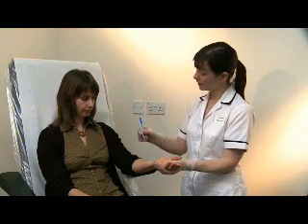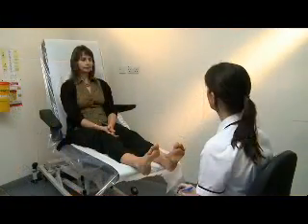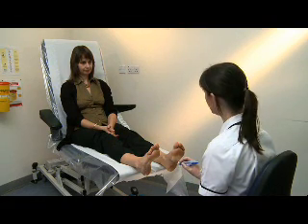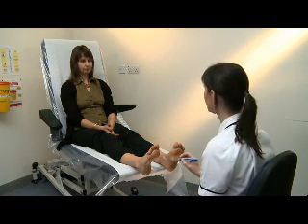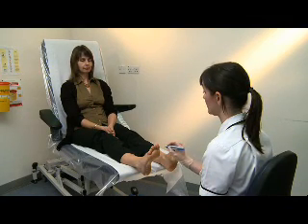And if you close your eyes, can you still feel it? Yes. Okay. I am now going to test the sensation in your feet, so if you'd like to close your eyes and just say yes each time you feel anything on your feet. Okay. Yes.